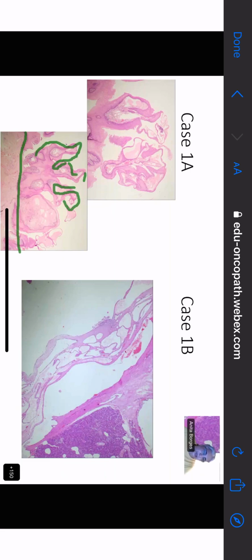Do you think that those are finger-like projections that reach the surface? Are they only finger-like projections, or are there some other projections that are not finger-like? Everything is finger-like? Not, ma'am. Not everything, but this thing is finger-like? No, ma'am. Not this, that one is not. So now, what kind of papilla are you going to call that? What sort of papilla are you going to call it?